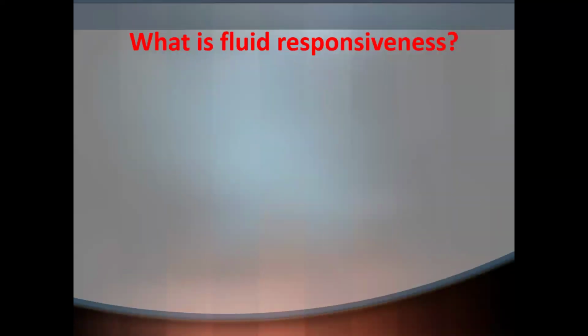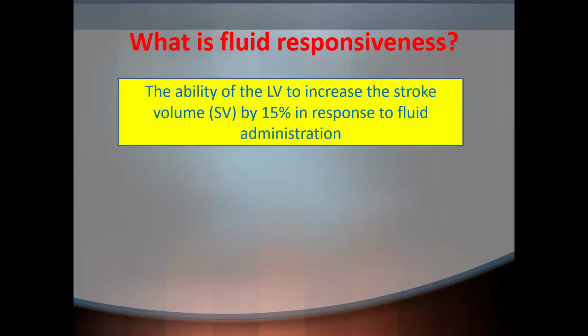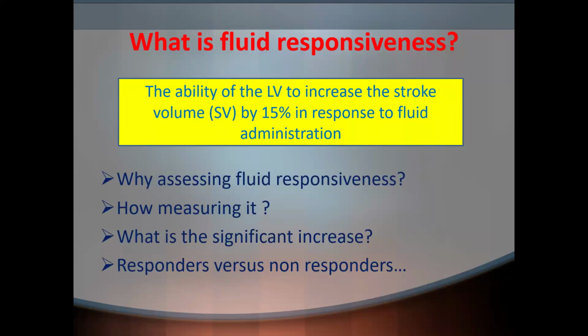What is fluid responsiveness? Most of the time in the ICU, we are asking whether this patient is responsive or non-responsive to fluid. Will the patient get better after a fluid challenge, or does he need a vasopressor or inotrope, as Dr. Mohamed said in the last lecture? The ability of the left ventricle to increase the stroke volume by 15% in response to fluid administration means the patient is fluid responsive.